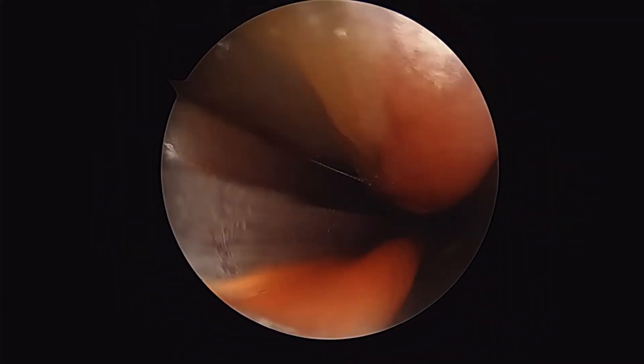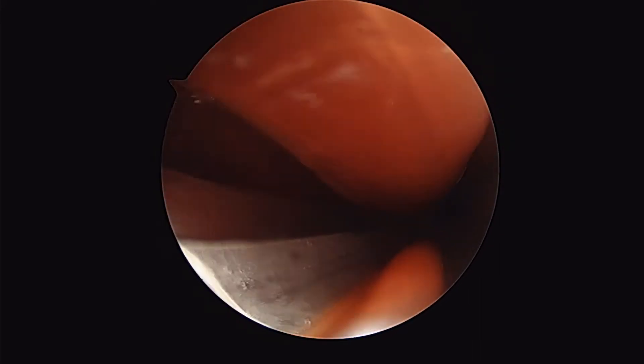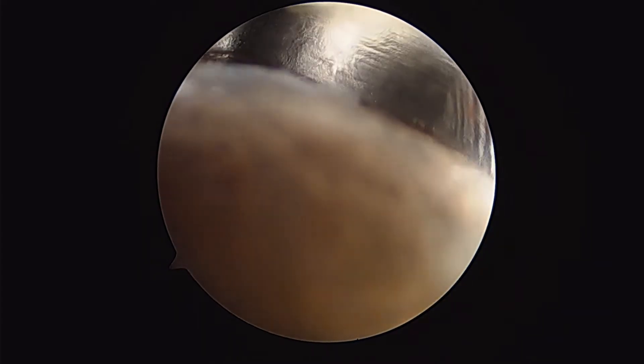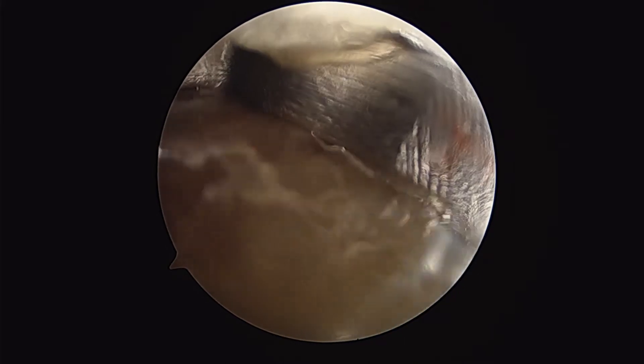Here you can see formerly I was above the fascia. Now I'm below the fascia. The muscle is well protected from being incised. Now I can advance my guide deeper into the fascia.